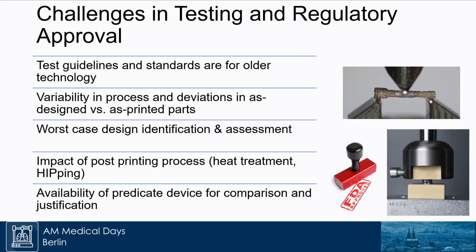Then there is the variability in the process and deviations. You always have an implant which is slightly different from what you designed in the computer.